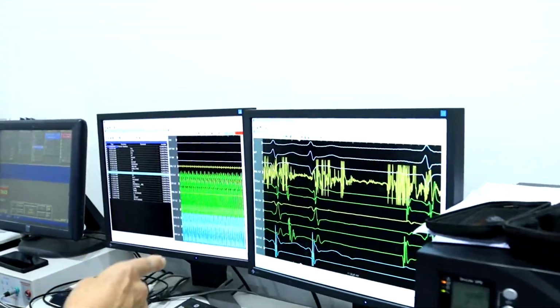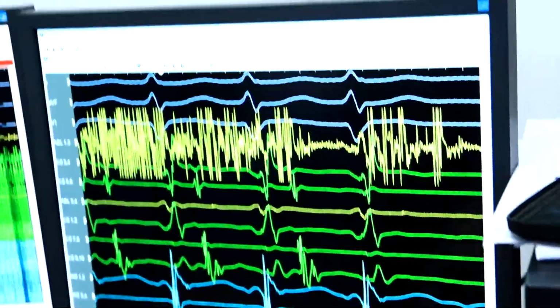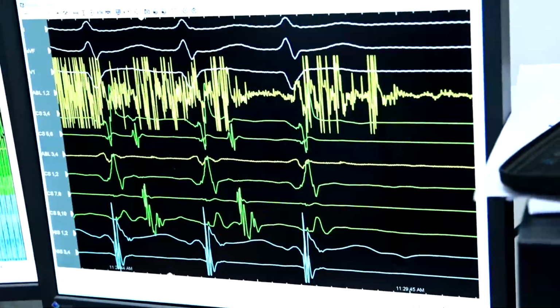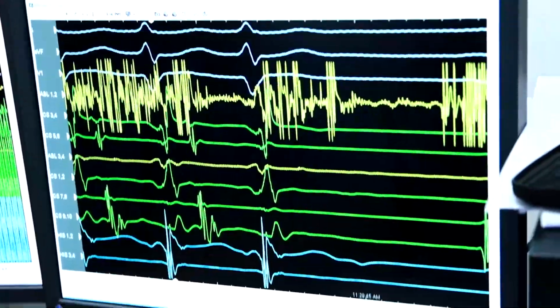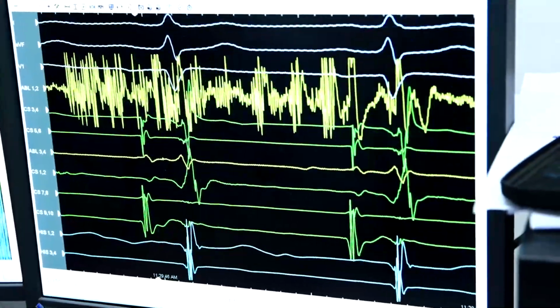But this is terminated in the atrial part. It could be in the retrograde, could be in the antegrade. We kept inducing this tachycardia without any potentiation with catecholamine. We ablated here, but still we had the tachycardia.